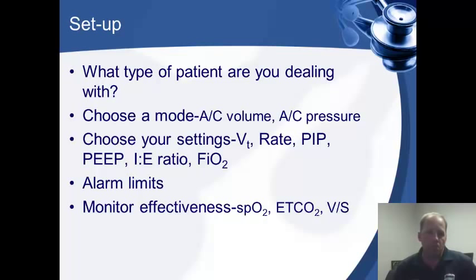You can up the upper alarm limits on your peak pressure if you need to. There may be other ones you got to change to keep it from alarming, but those are there to keep your patient from experiencing any high pressures or maybe low pressures, and let you know that something's not quite right. We'll talk about some changes that you can make there.